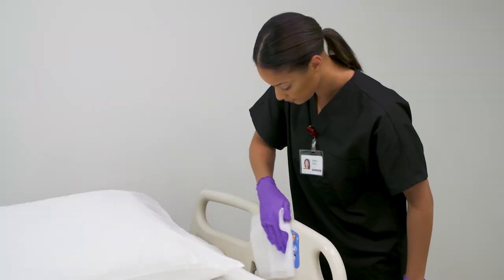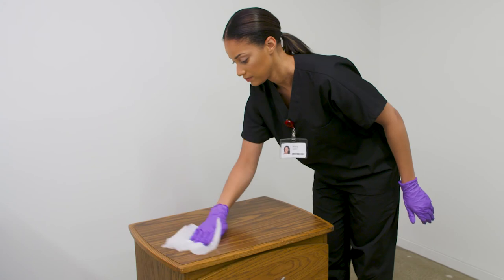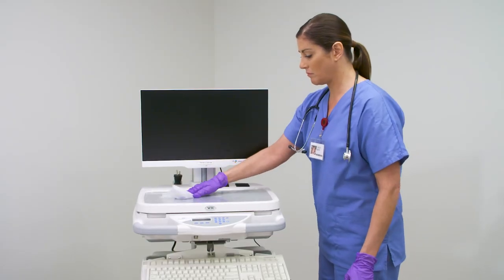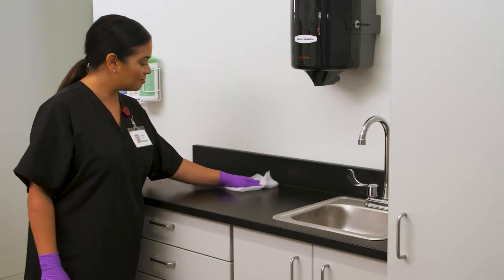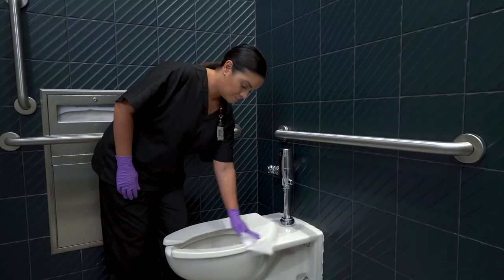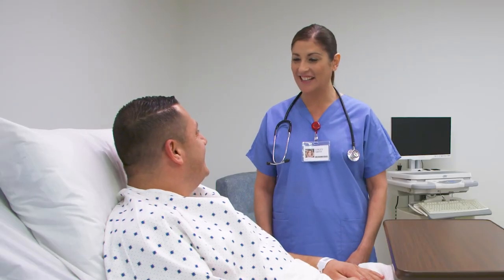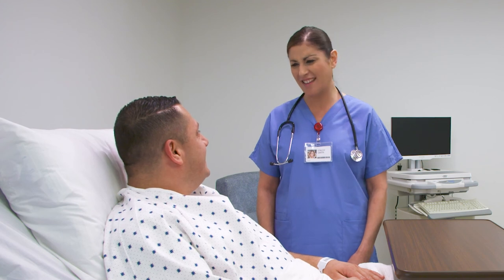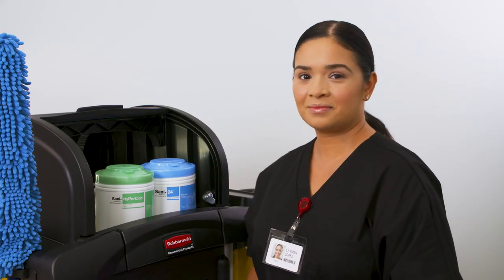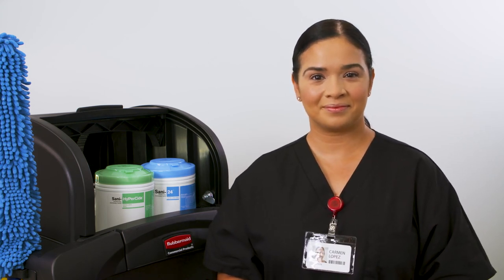Use Sani HyperSide germicidal wipes on high-touch surfaces such as bed railings, bedside table and handles, over-bed tables, workstation on wheels, telephone, as well as counters, sink fixtures, handles, and in the bathroom on sink, toilet, and shower areas. PDI is committed to providing breakthrough products for your infection-fighting arsenal with ready-to-use disinfectants and advanced technologies so that you can deliver the best in-patient care.